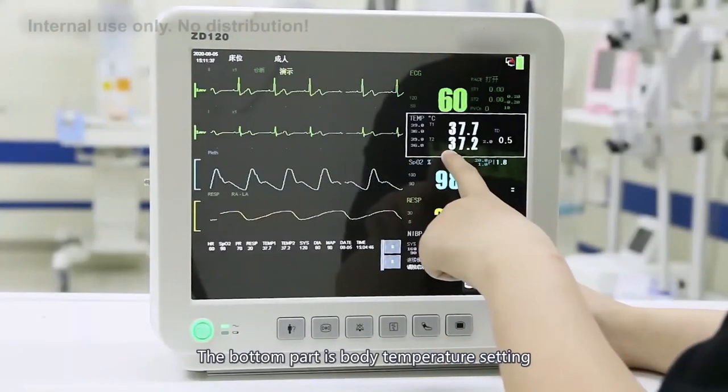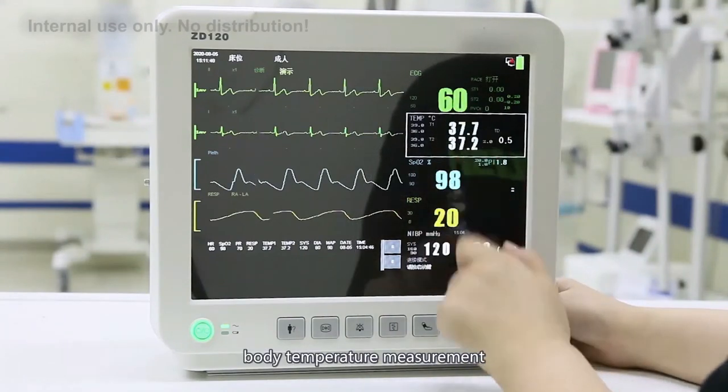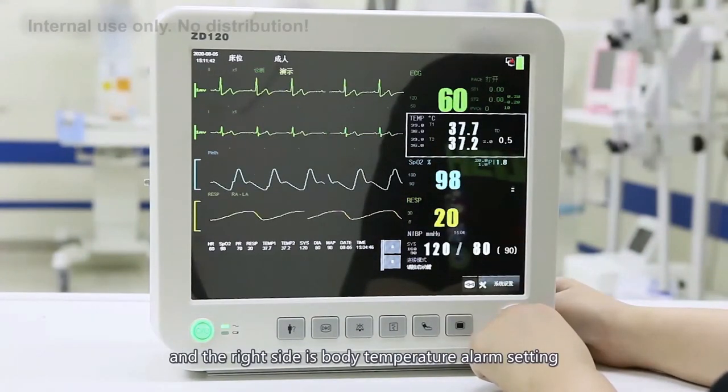The bottom part is the body temperature setting. The device supports dual-channel body temperature measurement. On the right side are the body temperature alarm settings.